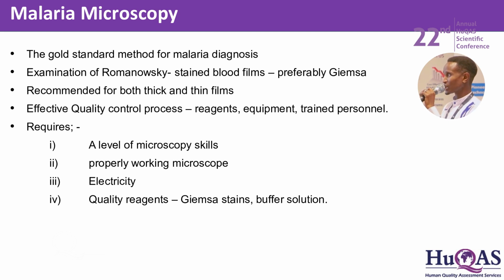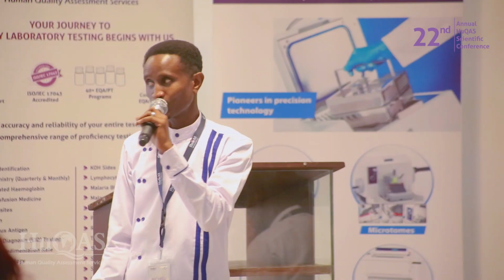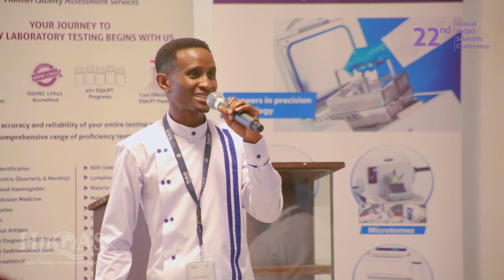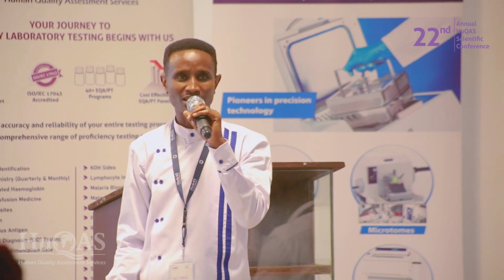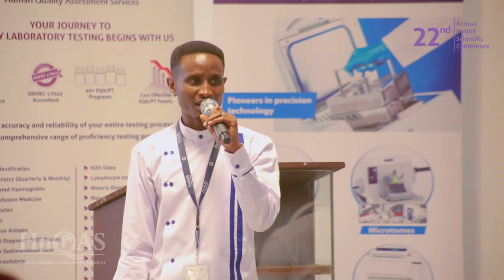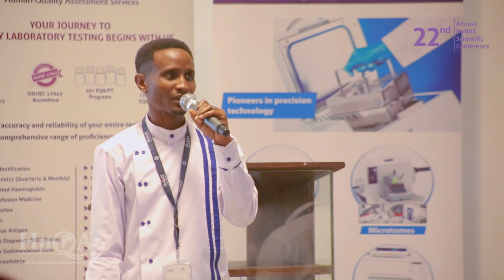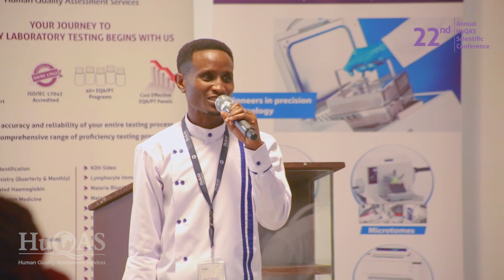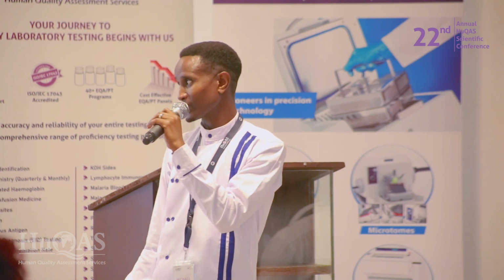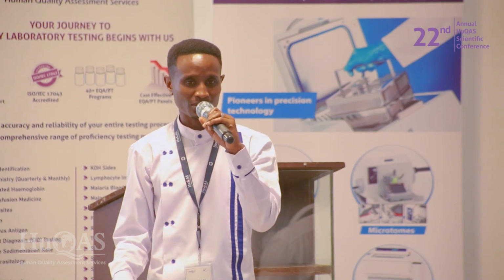Our requirements here, what we require, is to have a malaria microscopist who at least has skills and competency in microscopy, yes. A properly working microscope, and good reagents. Currently we have Giemsa stains which are in the field, but they could not be working very well for you. So yesterday we talked about quality control process. So do your due diligence, ensure the reagents are working for you properly. And then, of course, we have to have electricity for you to be able to work with the microscopes.